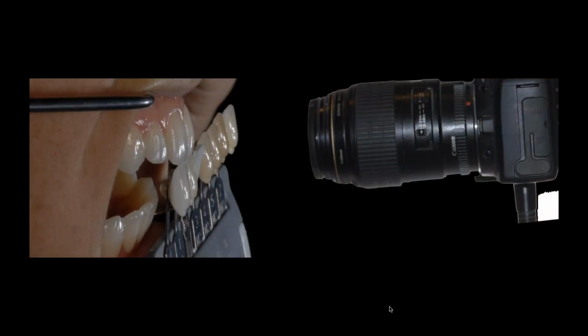Third thing is your shade guides. I've said this so many times, I feel like I'm repeating a broken record, but people still aren't doing it. I see clinicians still not doing it. The shade tab should be edge to edge to the incisal edge and in the same plane as the tooth, and then the camera should be shooting from up above or slightly above from the angulation of the tooth.